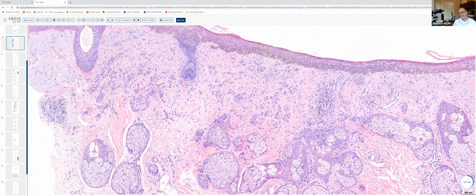I prefer the term persistent as opposed to recurrent. Certainly, recurrent melanocytic nevus is definitely well entrenched in the literature. In fact, what clinicians mean when they say recurrent nevus usually is they're seeing recurrent pigment. The nevus obviously never was completely removed. Otherwise, one wouldn't get persistence of the nevus. Sometimes the melanocytes that repopulate the lesion are either outside of the plane of the section, or they may be present in adnexal structures and not detected.